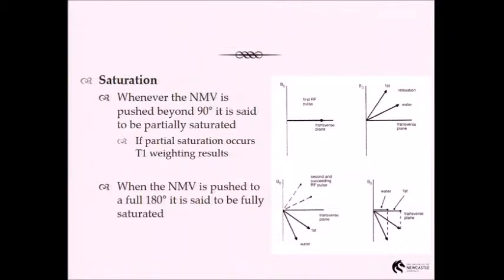I did mention this idea of saturation. Now, I looked at this a few times and thought, saturation is something that gets spoken about in the physical description of MR, but does it really matter clinically? And then I was reminded of a paper that I read a few years ago.